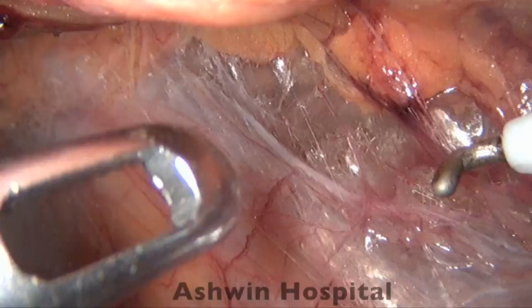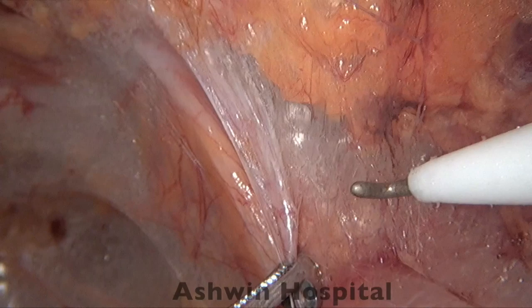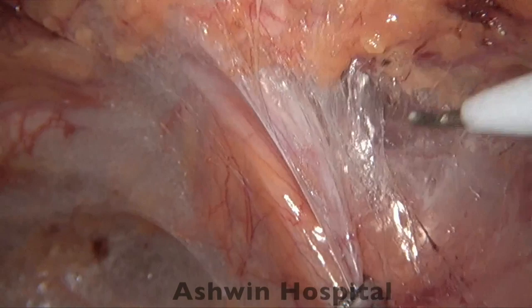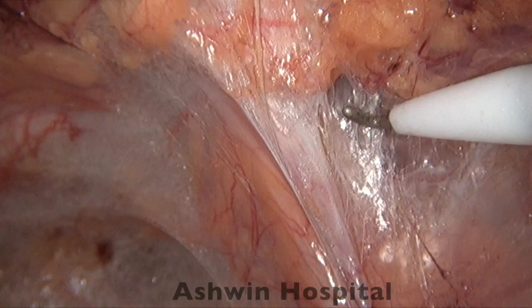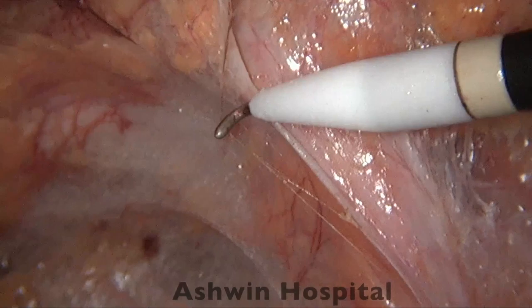So now we are making the working port. Both these working ports are made around 1-1.5 centimeters below the level of the umbilicus on either side of the midclavicular line, because this is a bilateral hernia. If it was a unilateral hernia, the left working port would have been done just to the left of the midline, medial to the inferior epigastric vessel. So here you can see we are encountering a direct hernia, and we are just reducing the hernia and pushing the transversalis pseudosac away.